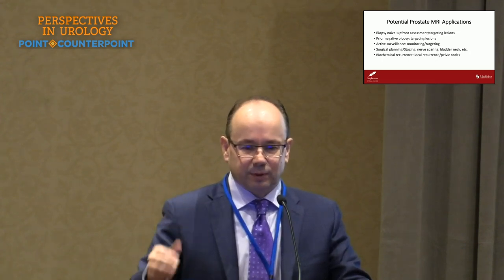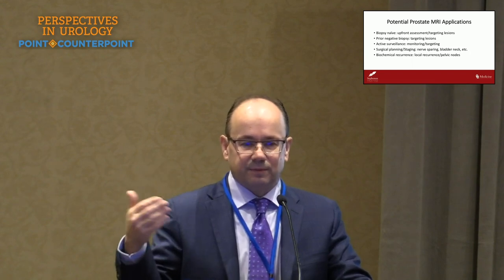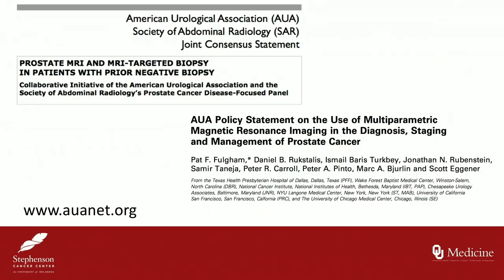Active surveillance and monitoring is an important use, at least in a lot of patients' practice, including ours. Then surgical planning, surgical staging, and even assessment for biochemical recurrence. But we're going to focus on the top three, given the time constraints.